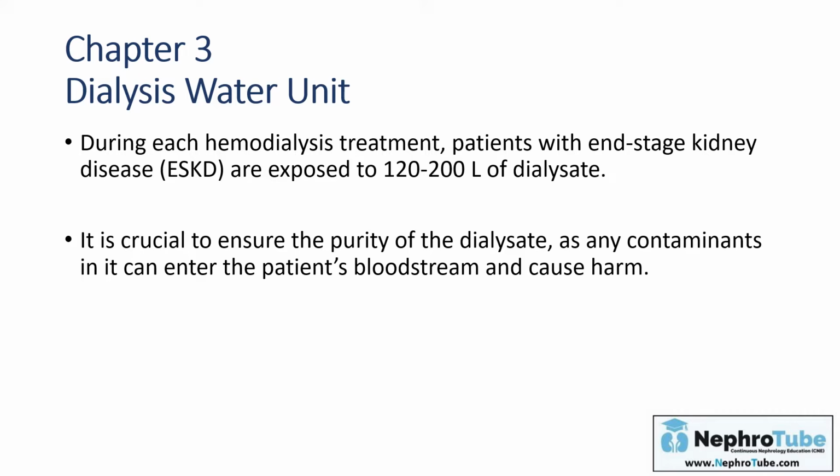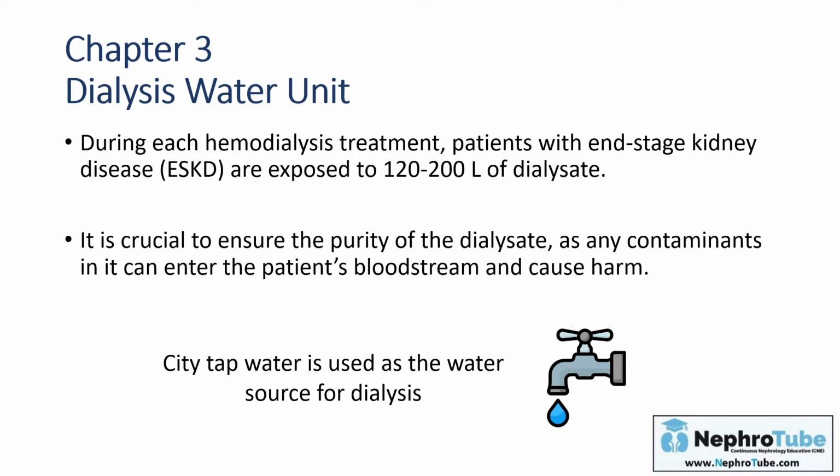The main source of the dialysis water is the city tap water, which usually contains contaminants and ions that must be cleared before this water forms the dialysate that will be exposed to the patient's blood.